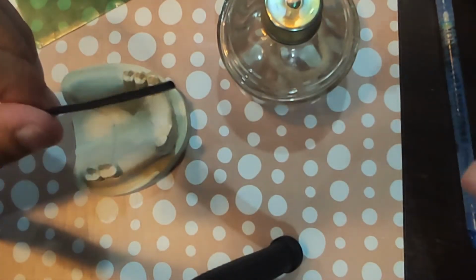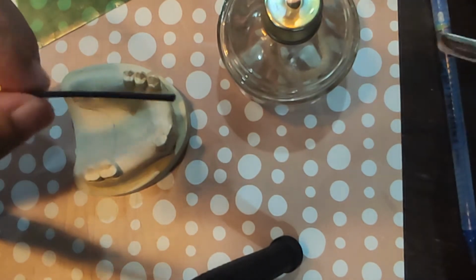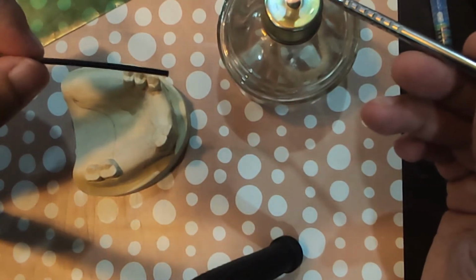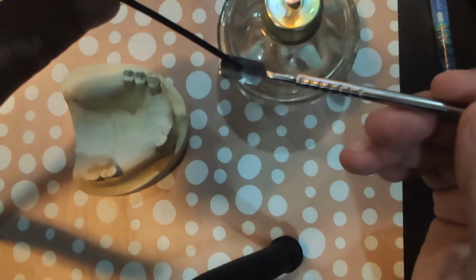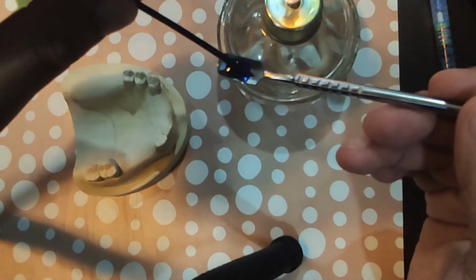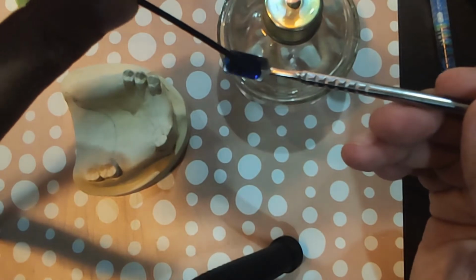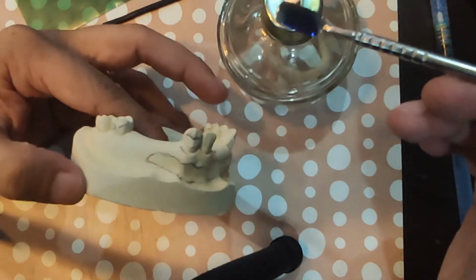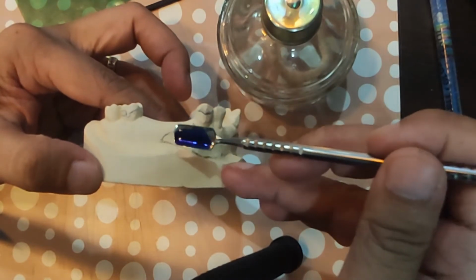I have plenty of half round gauge, 6 half rounds, so pwede ko siyang gamitin. I can use the blue wax to block out the undercut here.